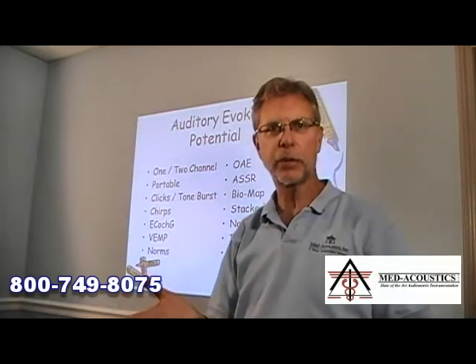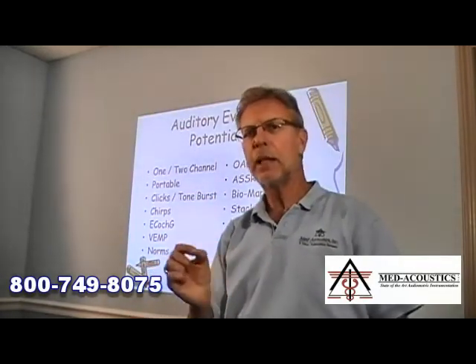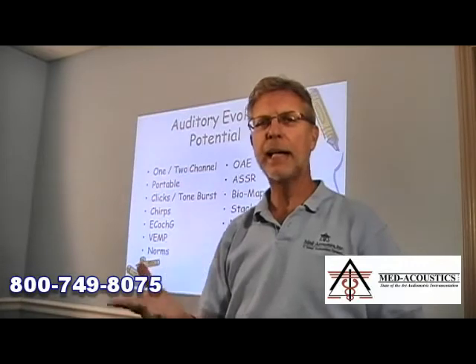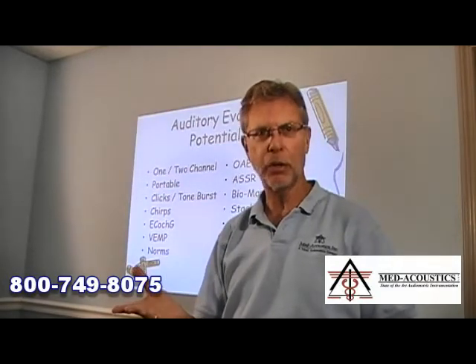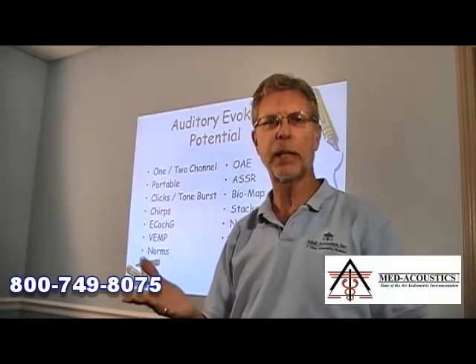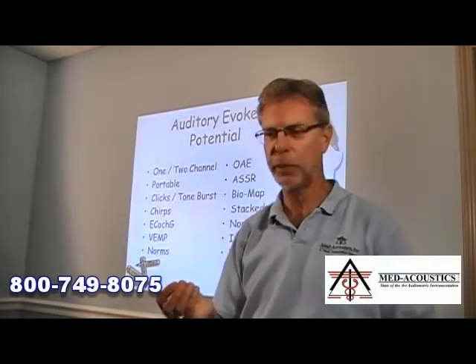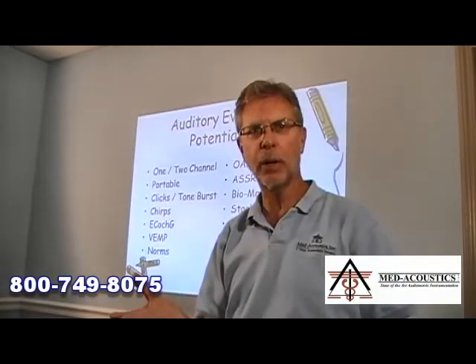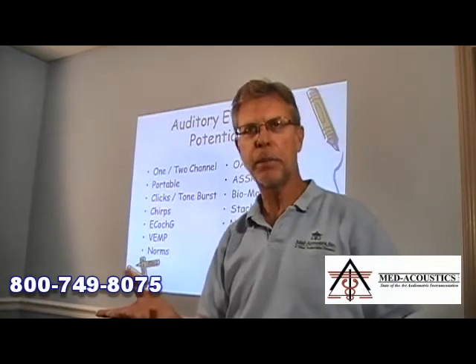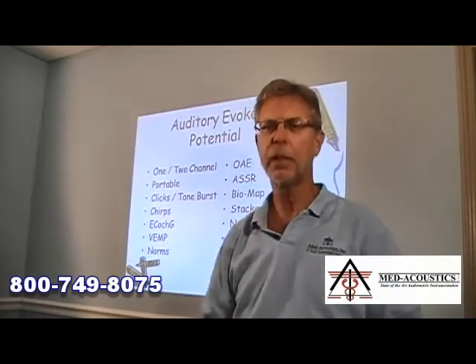Are we going to be doing electrocochleography? Are we going to be doing VEMPs? Do we want built-in norms for latencies? Is that important to us? Will we be adding another function like otoacoustic emissions? And if that's something that we can add, is it viable from that particular manufacturer? Some OAE systems are more viable than others. What about ASSR? Will we need that? And if we do, is that a viable function on the unit that we're ordering? Do we understand its application?